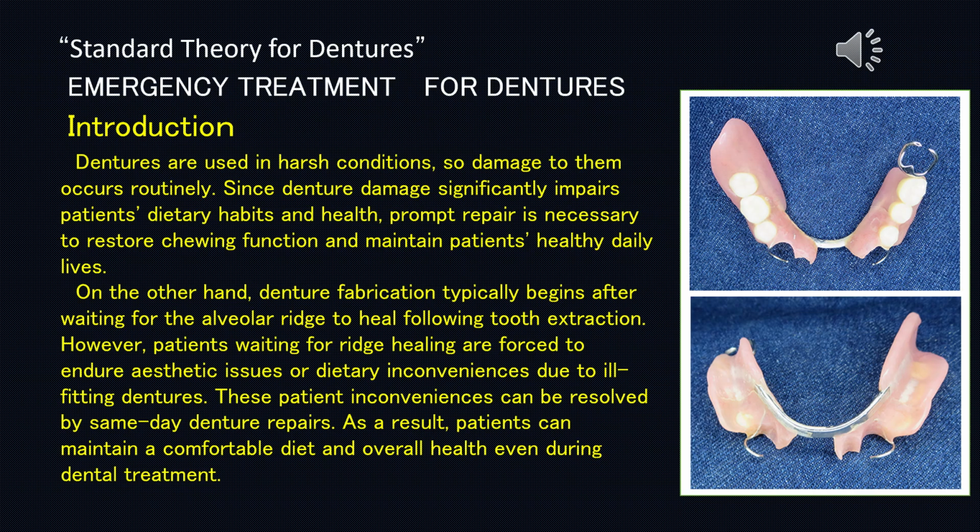following tooth extraction. However, patients waiting for ridge healing are forced to endure aesthetic issues or dietary inconveniences due to ill-fitting dentures. These patient inconveniences can be resolved by same-day denture repairs. As a result, patients can maintain a comfortable diet and overall health even during dental treatment.